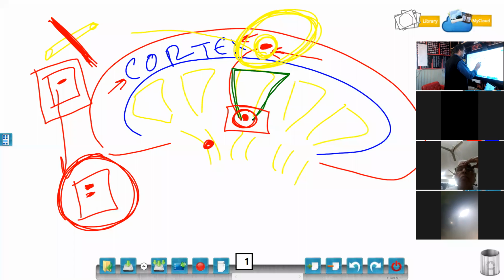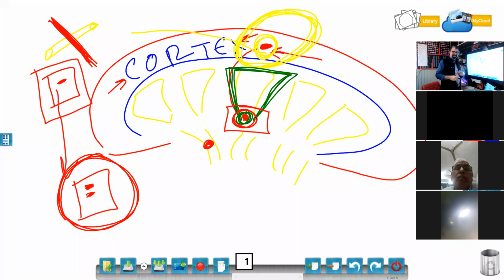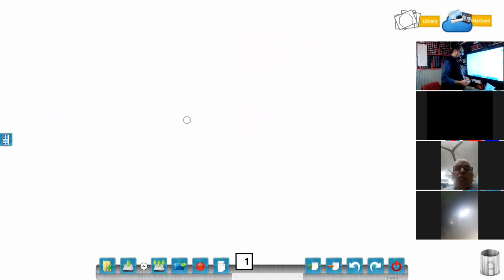So if you see a proximal dilatation of a pyramid, that confirms that this small structure is a calculus, because the pyramid is dilated. Now see again how important the anatomy is. So know your anatomy, know your anatomy, and know your anatomy. I suggest you go back to the classes and go to the first class. That is very important for understanding the sono anatomy. We call it sono anatomy.